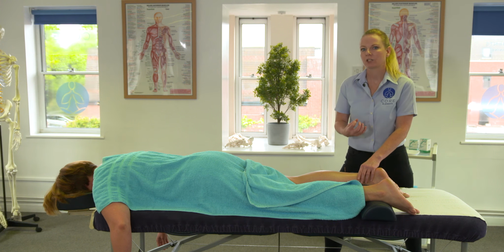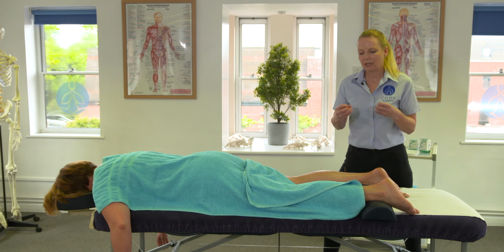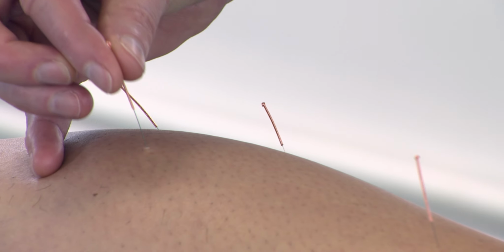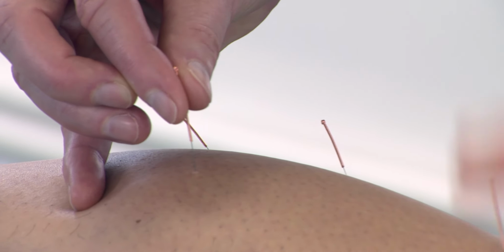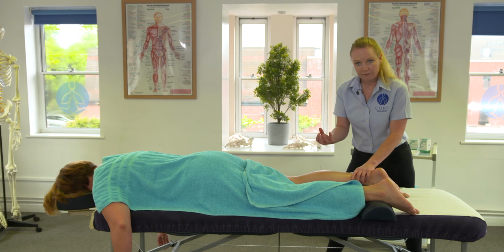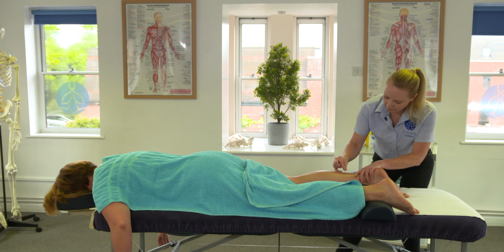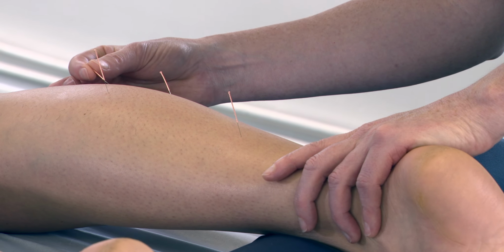And we know if we stimulate a twitch response in the tissue, that leads to rapid depolarization in those muscle fibers. So I'm going to start with this one, which is over that common trigger point area. And I'm just literally moving that needle up and down. I'm holding onto Katie's leg here, just in case she gets a strong twitch, because often if the client gets a strong twitch, she might jump. Okay, how are they feeling? Yeah, I feel more. Okay, and the last two, just peppering those needles.